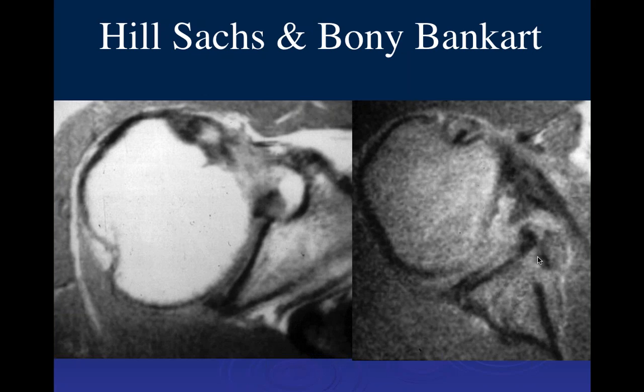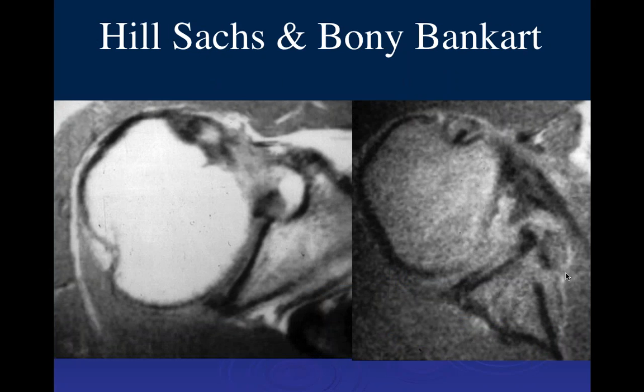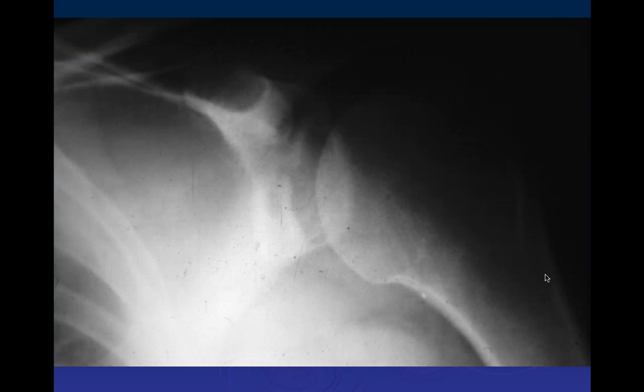Okay. So this is, as John said, a bone fragment. This patient had an acute anterior dislocation, does not have acute bone marrow edema at the Hill-Sachs lesion, but has an acute fracture of the anterior inferior glenoid. So this is a bony Bankart. Way back when all we had was x-rays, that's all we had to go by. And we always thought what you're looking at on the x-ray was a fracture and had to be ruled out. Yes.